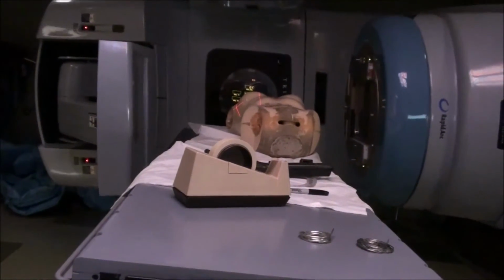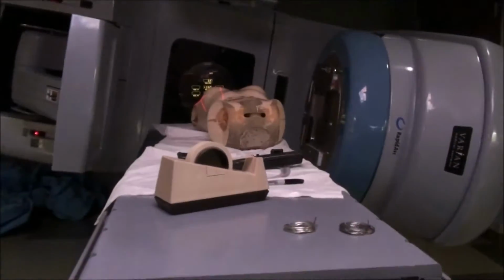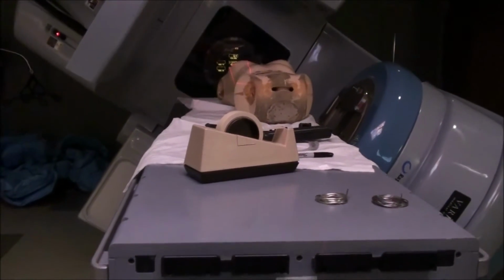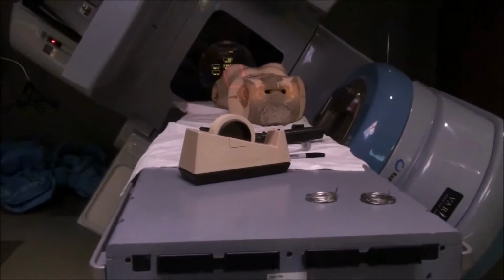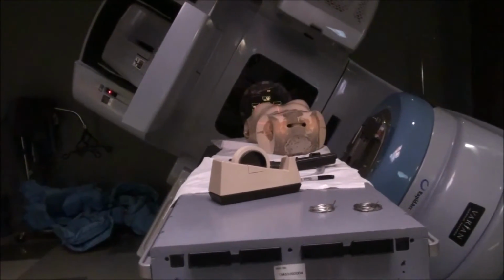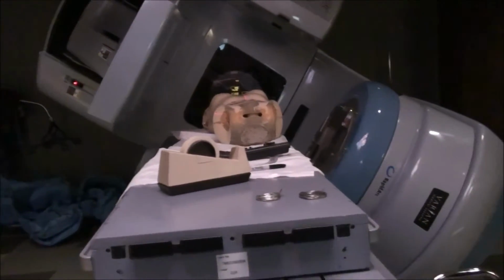Once we get clear of everything, we're going to go to our opposite gantry angle, and then we're going to make sure and move your patient back to where they were in the first place. You have to get her back onto her isocenter. Let's see, 982.1.